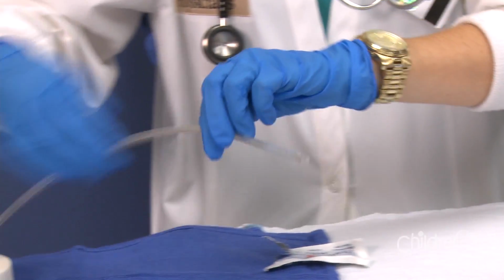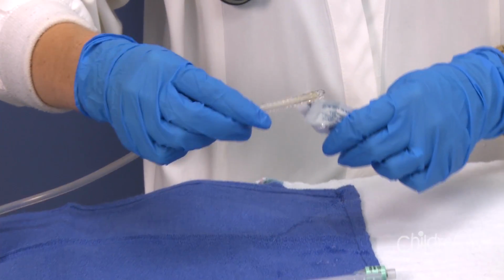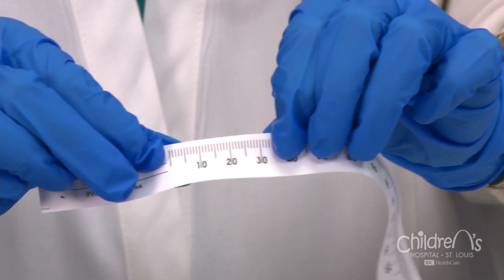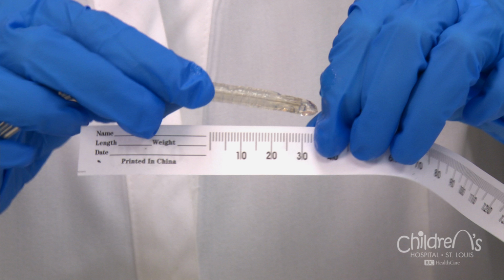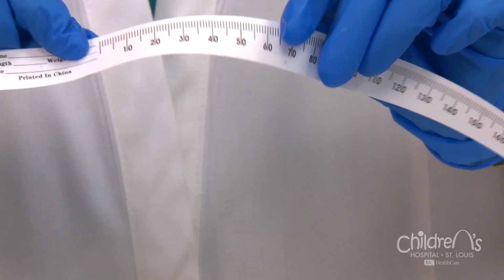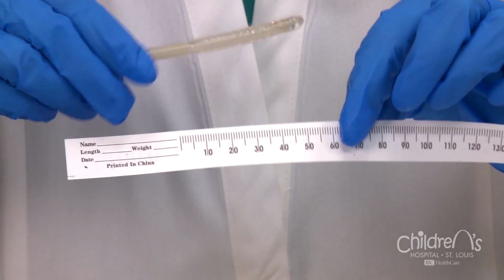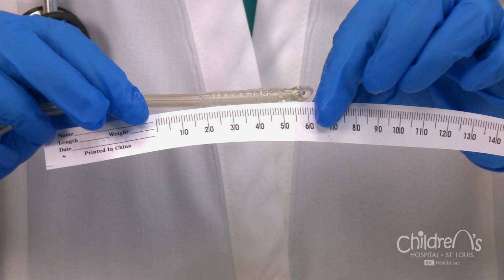Put a small amount of water-soluble lubricant on the tip of the Foley. If your child's weight is less than 15 pounds, gently insert the tip of the Foley about 1 1/4 inches or 3 centimeters. For children who weigh more than 15 pounds, insert the Foley into the gastrostomy tract about 2 1/2 inches or 6 centimeters.